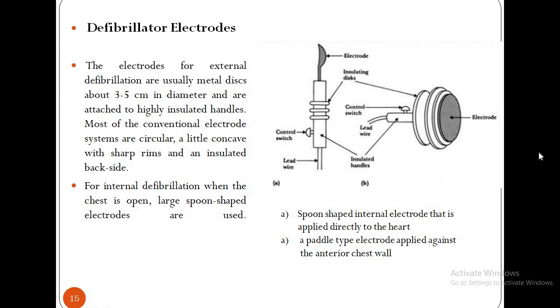Usually, large currents are required in external defibrillation to produce uniform and simultaneous contraction of the heart muscle fibers. The external electrodes contain safety switches inside the housings, and the capacitors discharge only when the electrodes are making good and firm contact with the chest of the patient. This precludes the possibility of an accidental shock to the operator and the risk of burns to the patient.